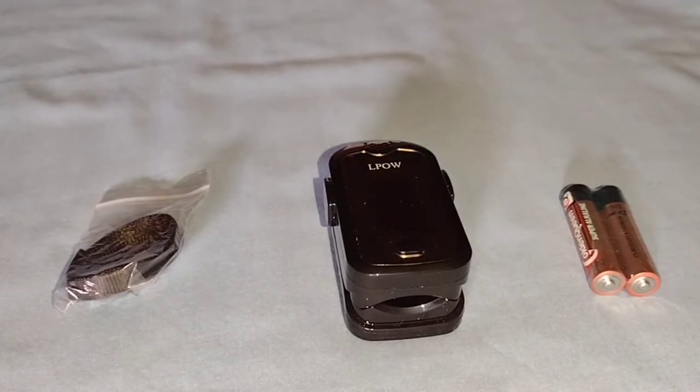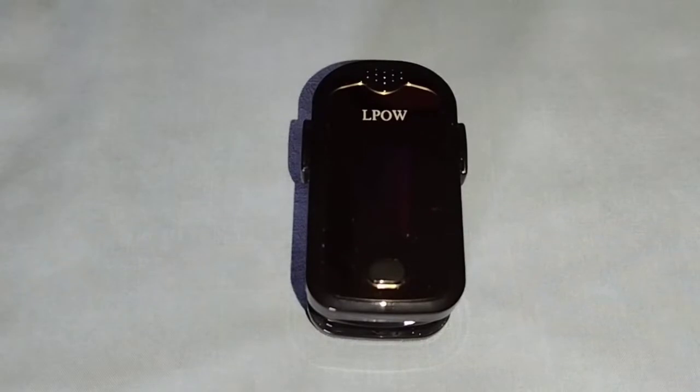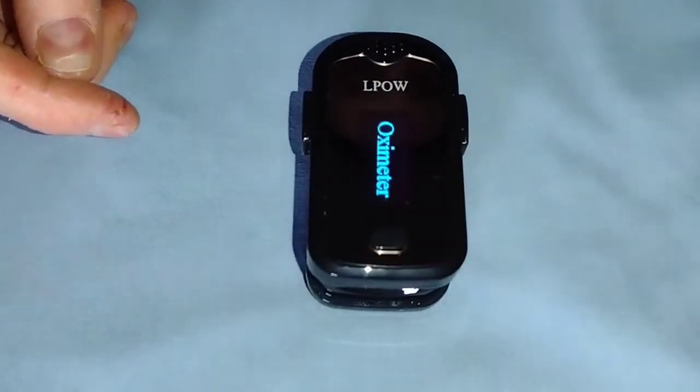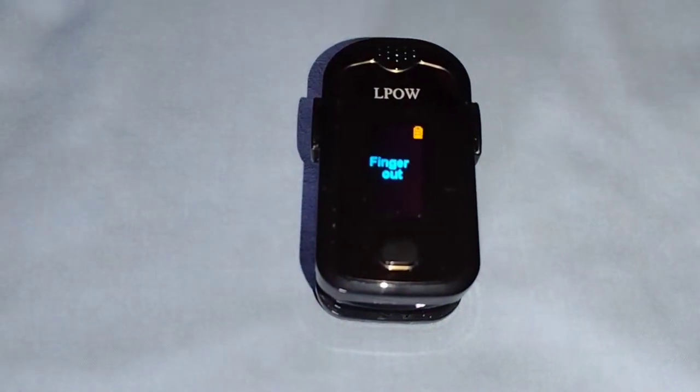Now putting the batteries inside the oximeter to get it powered on — it's very simple. You hit this button right there and boom, it's on immediately.